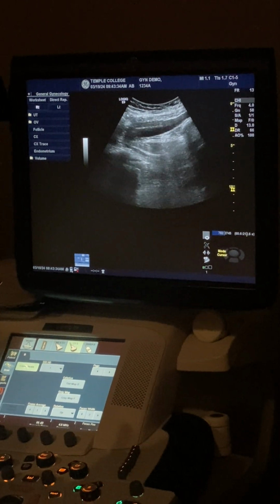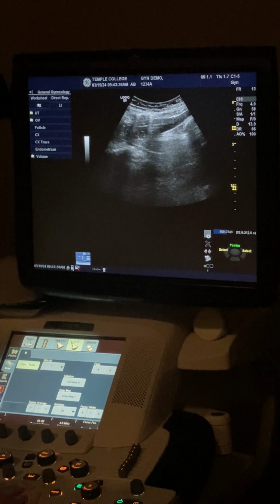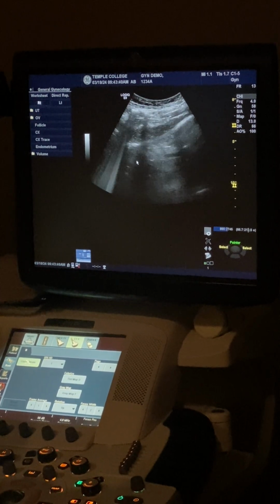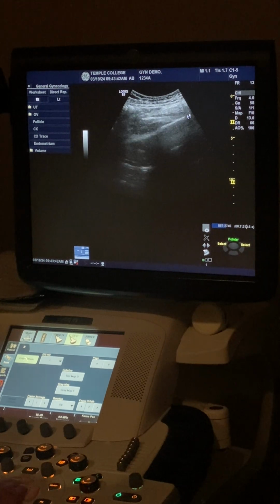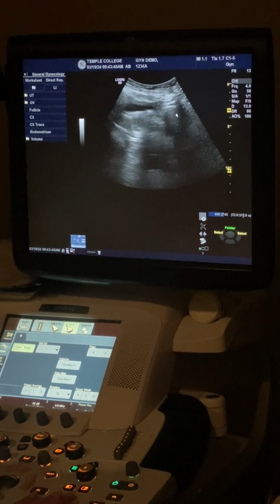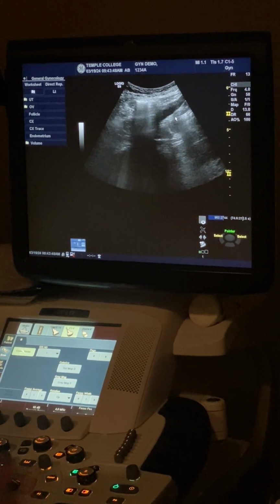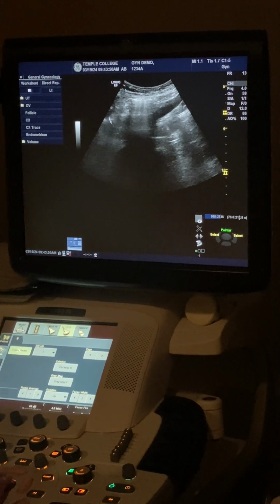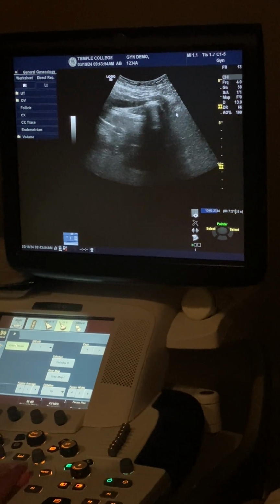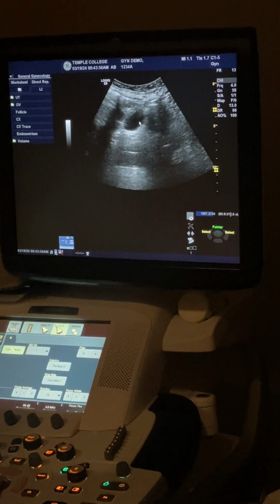So I'm going to go all the way out, and these are her iliacs. This is her hip bone. So I have gone as far as we can go, okay? This is her hip bone right here. So I'm going to angle up here, but I don't want to just get this. You see what I'm saying? Just this iliac here and then bone and space. What I'm evaluating is the adnexa, the space between uterus and iliacs.